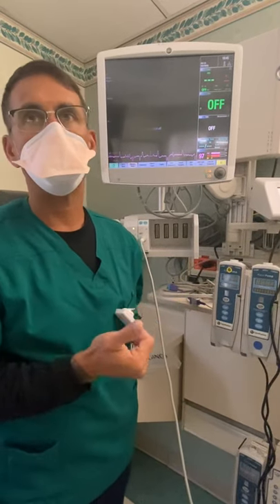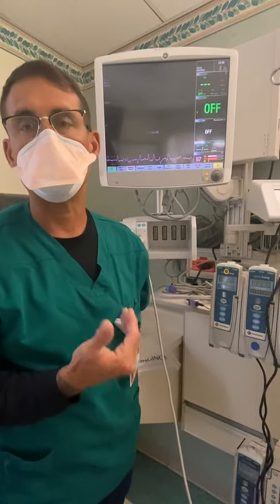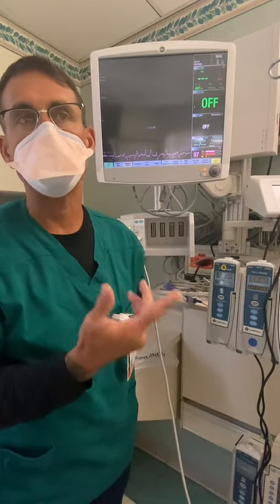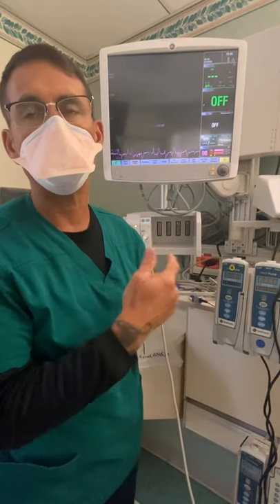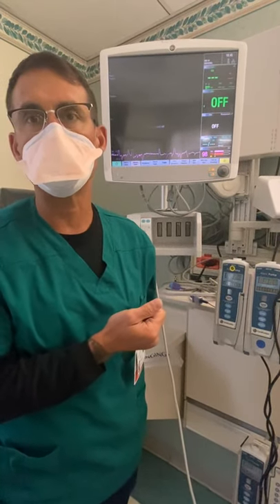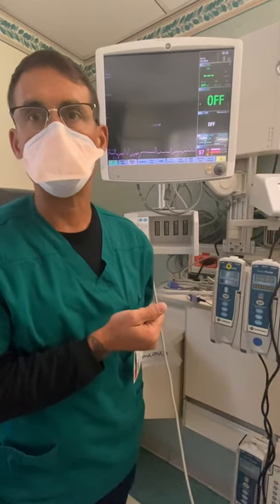The new order for assessing sedation in paralyzed patients will tell you what you have to do, and I'm going to tell you now. Example number one: if you walk into your room and open your door, and as soon as you come in the room the patient's vital signs go up, their heart rate goes up, their blood pressure goes up, that patient is awake. You need to give more sedation.